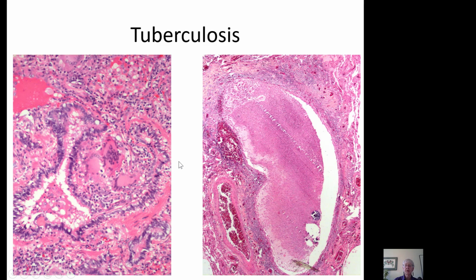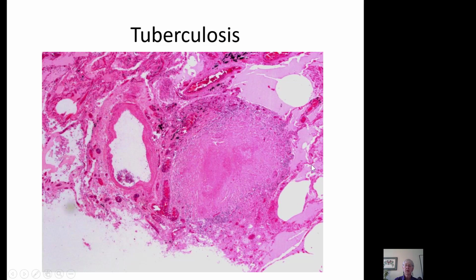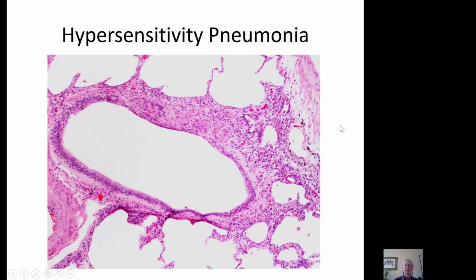This is an example of infection. I've chosen to illustrate tuberculosis. Here's a relatively well-formed granuloma, which is protruding into this airway lumen. And on this section, the granuloma is associated with a marked degree of necrosis. In this section, the airway has been completely destroyed by the presence of this necrotizing granuloma. See the necrosis here in the center.